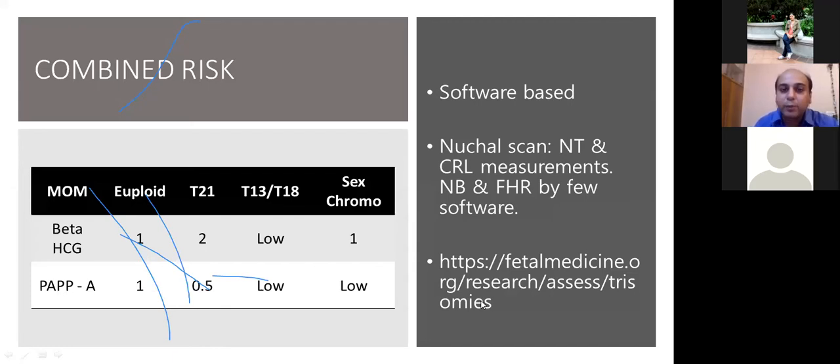For this site we go to the date of today's scan, and then we put the date today. Now that we are doing a nuchal scan, we don't have biochemical markers. We select no for PAPP-A, no for beta HCG. We put the date of birth, a random date of birth for some; we can put the date of birth of some 20 years, 25 years behind. So we can keep it 88.